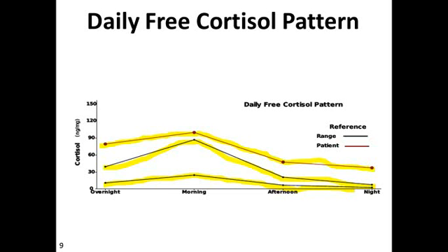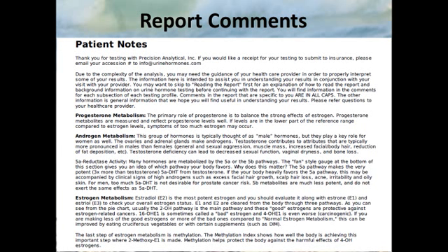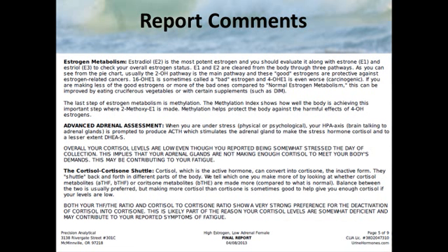That concludes the report, and I hope that will give you a little bit of context in terms of trying to understand those results and what those numbers mean. Lastly, there are comments specific to your patient. The first is the patient comments, which can be seen as introductory level comments regarding the results. When you see comments that are in lowercase, those are educational generic comments that we hope will help you understand. And then the all caps comments there are specific to the results, symptoms, and demographics of your patient, very specific to your situation.